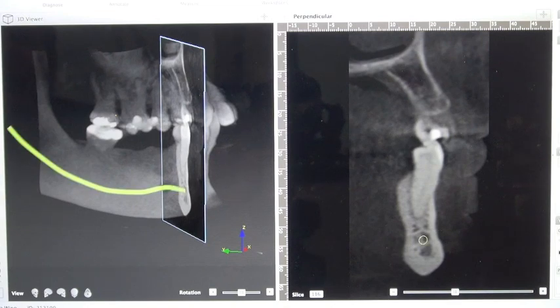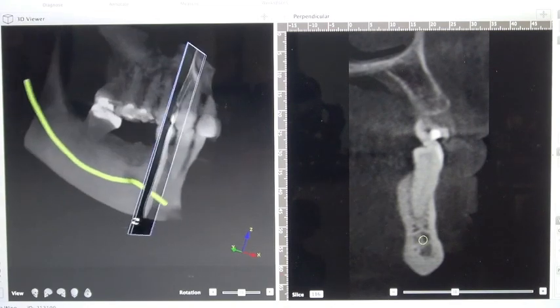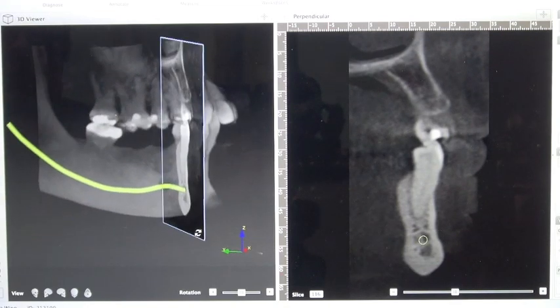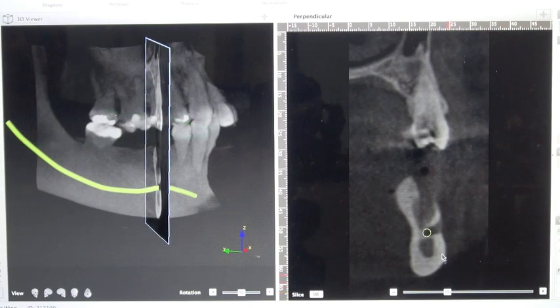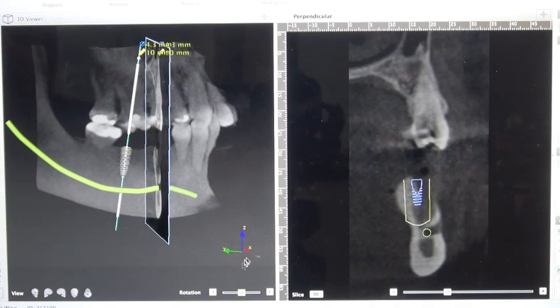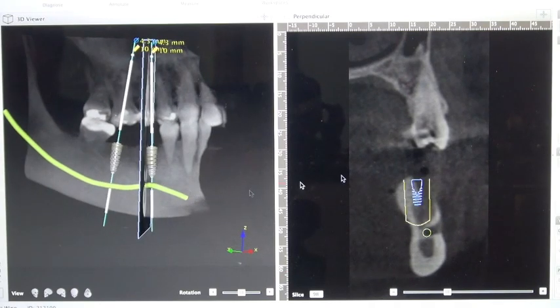If we look at the nerve in this case, we can see that there is an anterior segment — the incisive nerve. If we move back, we can see where the mental foramen is, and this allows us to know where we want to place the implant. So if we were doing an anterior implant, we'd have to be careful of that incisive nerve.